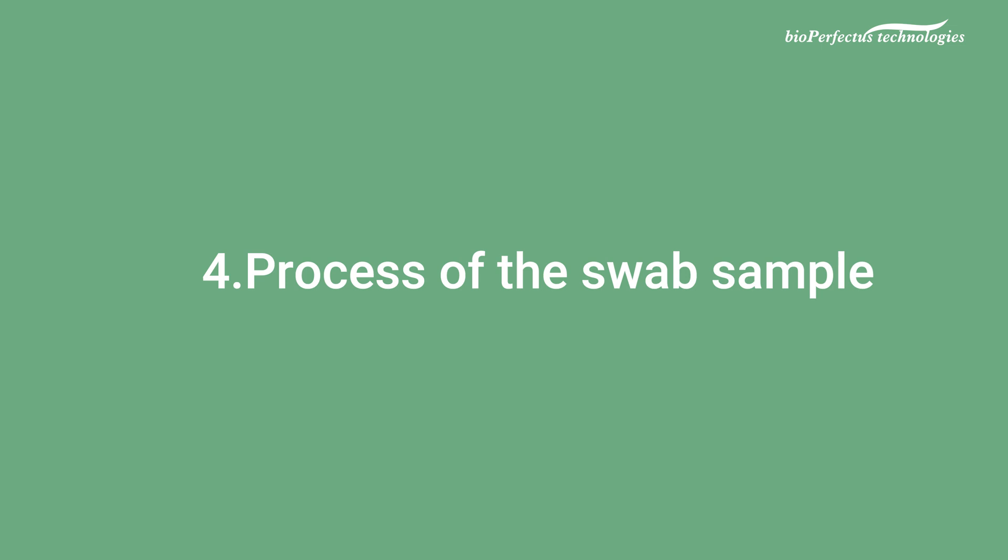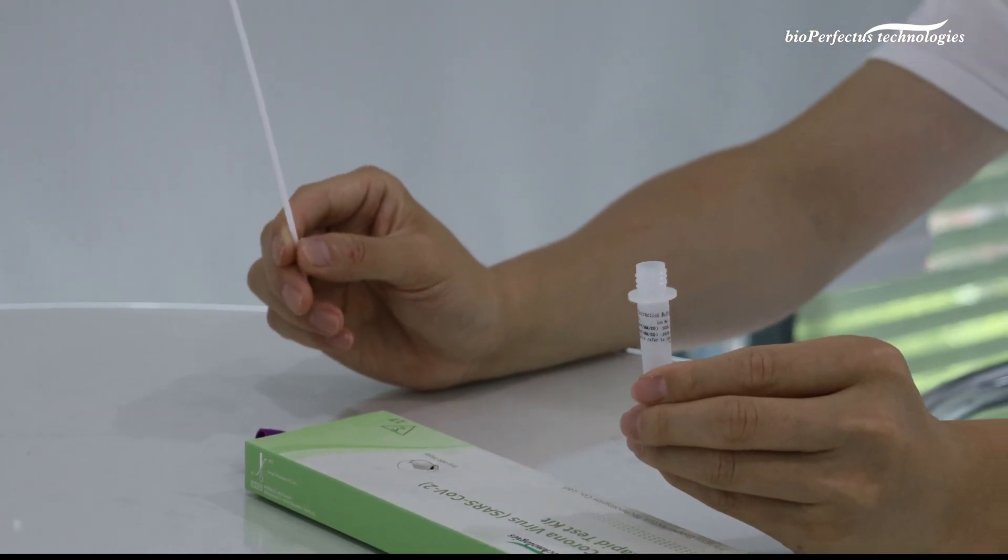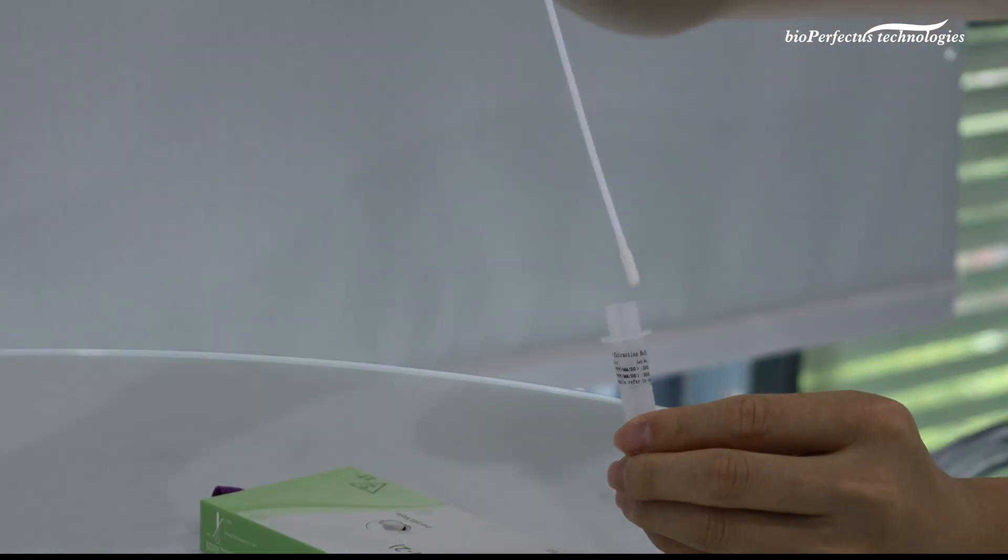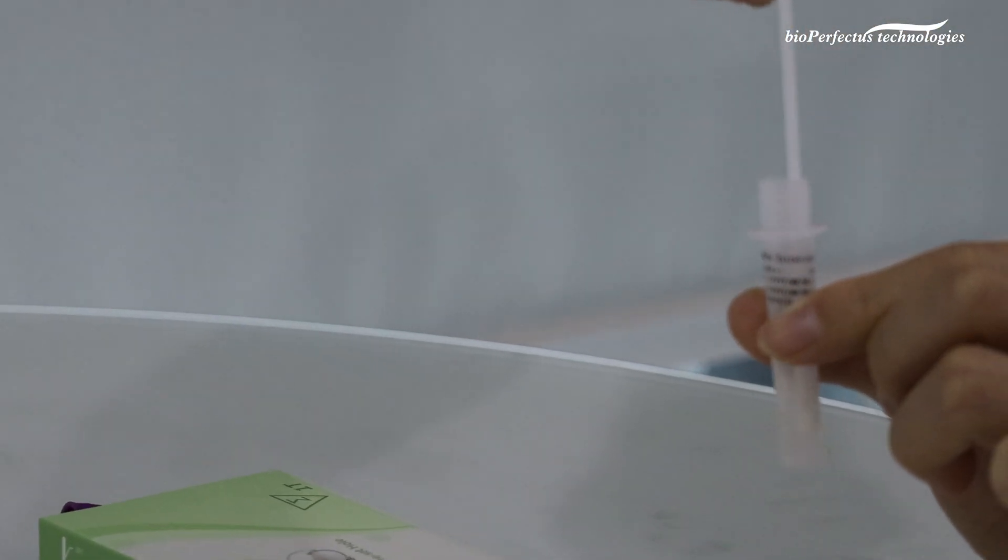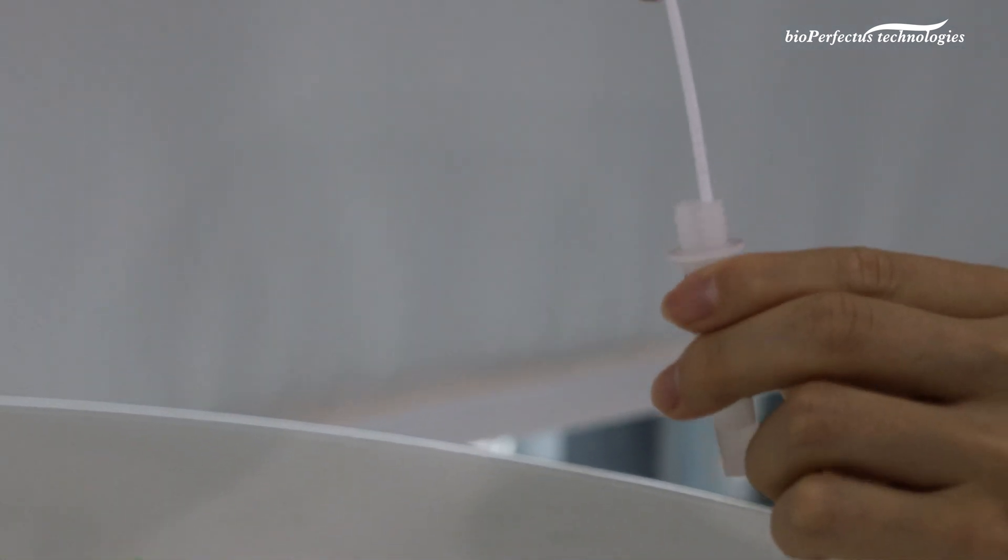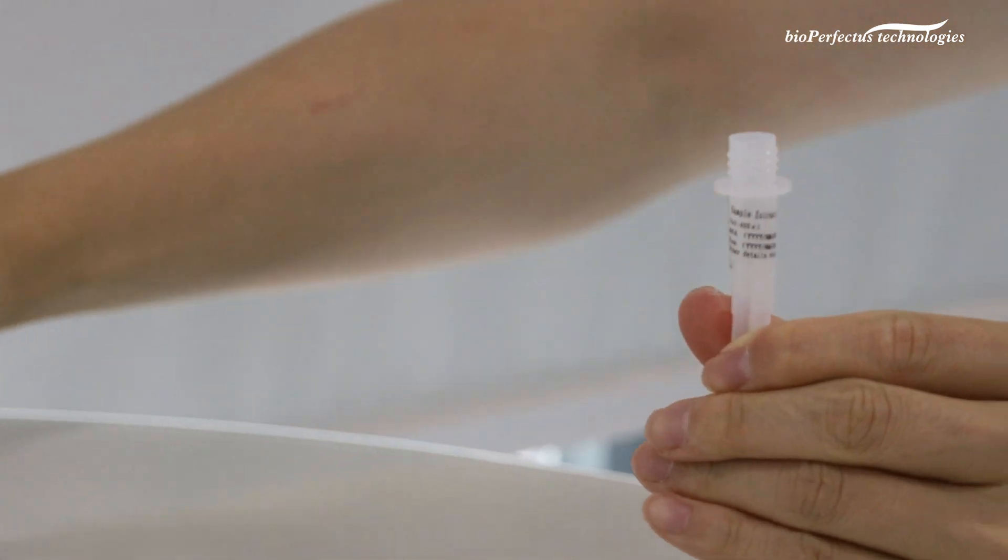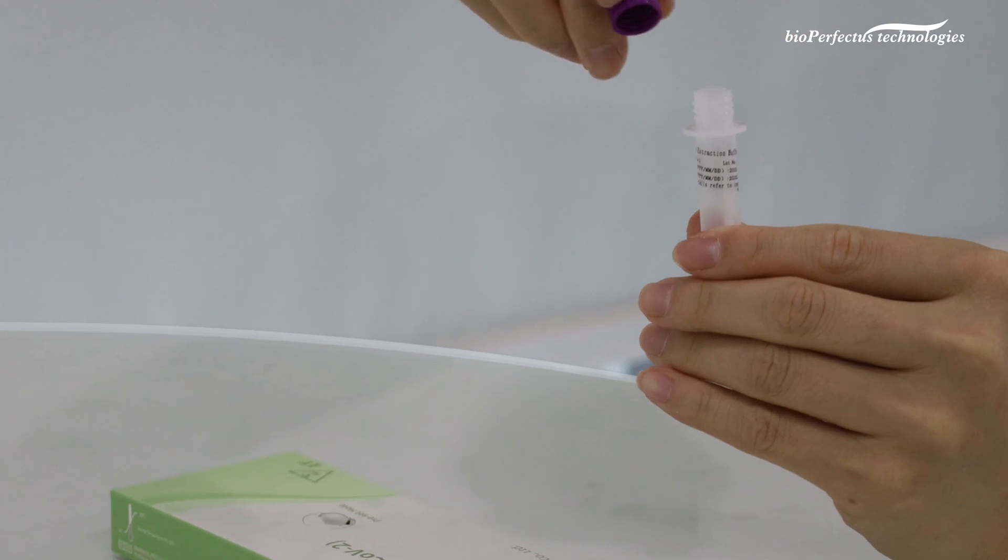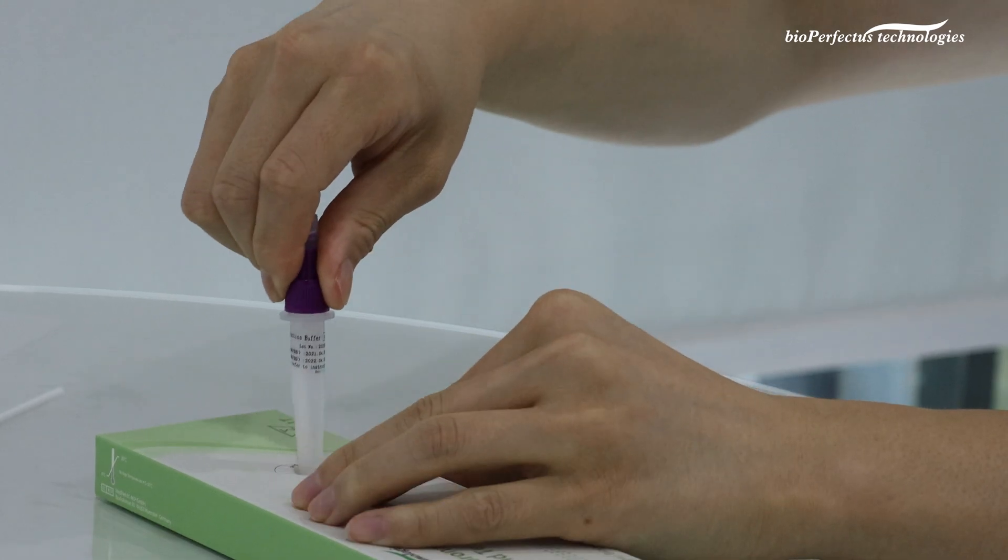Step 4: Process of the swab sample. Take the pre-packed extraction tube out from the preset hole. Place the swab into the tube. Insert the swab fabric into the tube, and squeeze the tip of the swab through the tube for 10 times while rolling it around the tube. It is important to mix thoroughly. Remember to break the swab, and leave the head of the swab in the tube to allow the fully absorption of the sample. Screw the purple cap on the tube tightly to avoid any leaks.